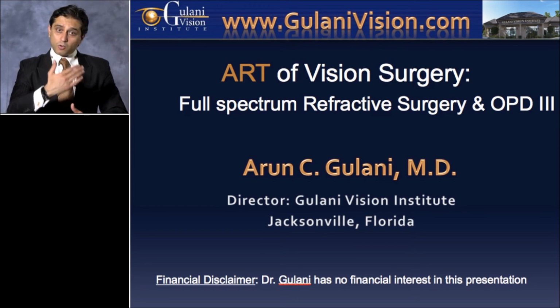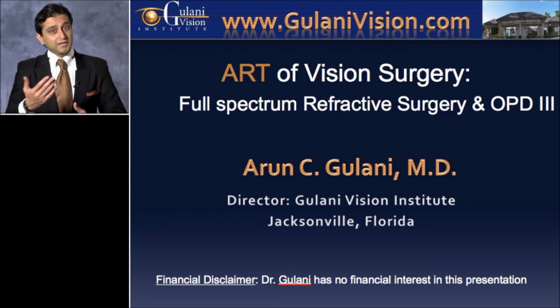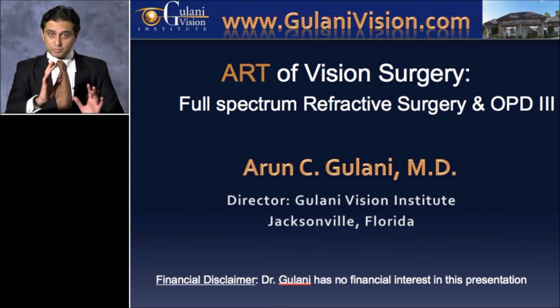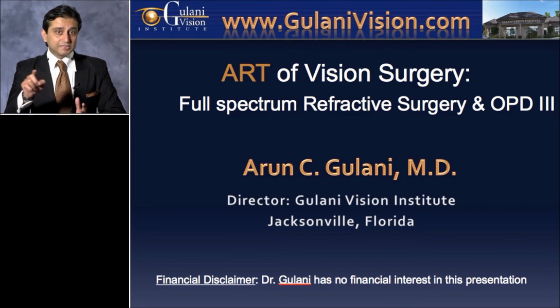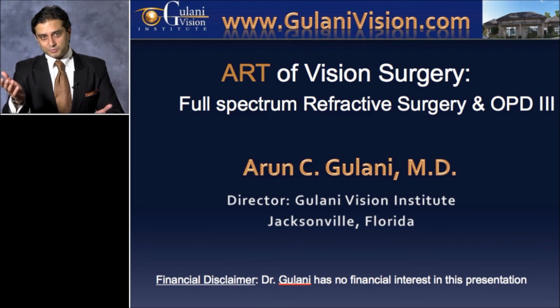Is it the cornea that's causing the impact of poor vision? Is the premium IOL the source of glare, or is it the astigmatism residual in the cornea? Is the patient's visual capacity affected from LASIK ectasia, keratoconus, impending cataract with keratoconus? And therewith, you come up with a plan of correcting each element in single or staged concepts to excellent vision.